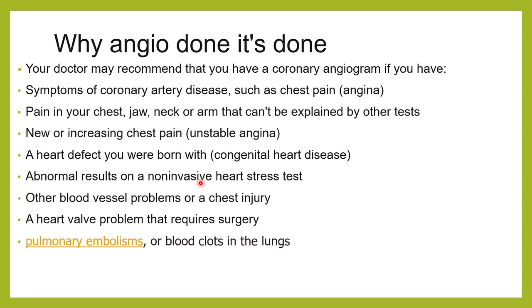See, ECG or echo, they won't tell you that you have a block. They only tell you when the muscle is damaged. If there's a heart attack, yes, we can make out that there is a heart attack, there is an MI. But to see if there is any block and how much is the block, we need an angiogram.